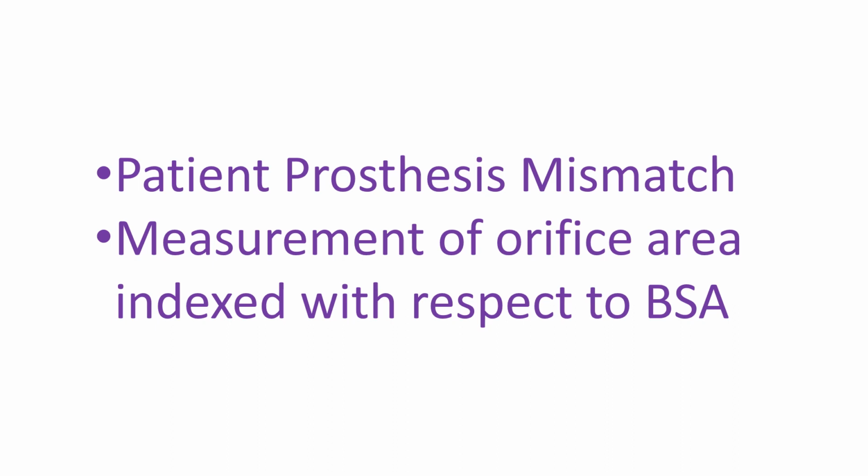To put it simply, a prosthetic valve too small for the patient's body surface area produces this situation. It produces an increase in transvalvar gradient, but imaging studies like echocardiogram, fluoroscopy, or computed tomography will show absence of thrombotic masses and pannus. Normal valve opening angles will be documented. Measurement of the orifice area and calculating the indexed area with respect to body surface area will differentiate it from other causes of prosthetic valve dysfunction, which can also increase the gradient.